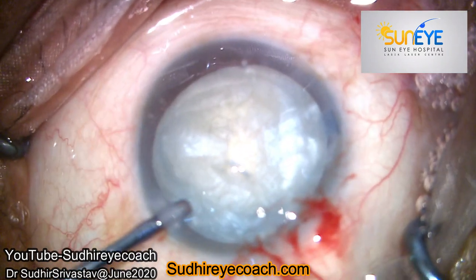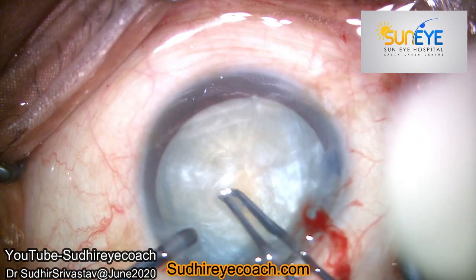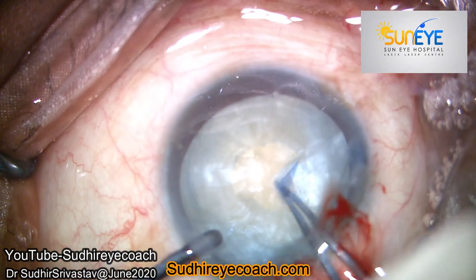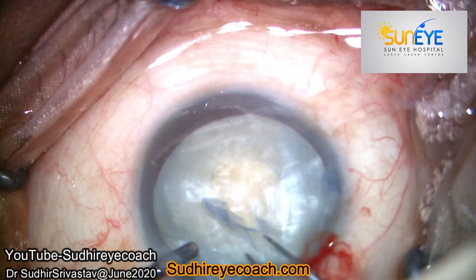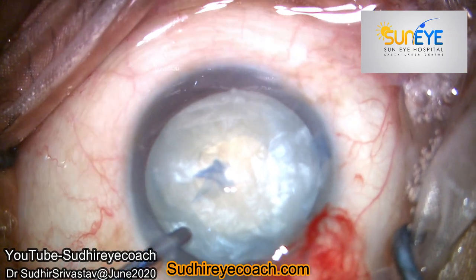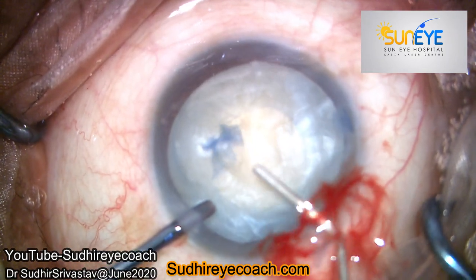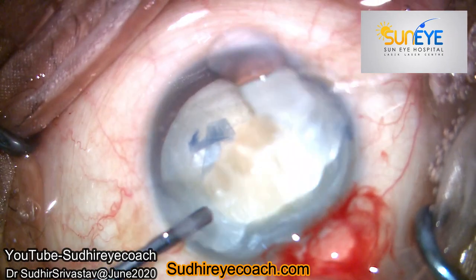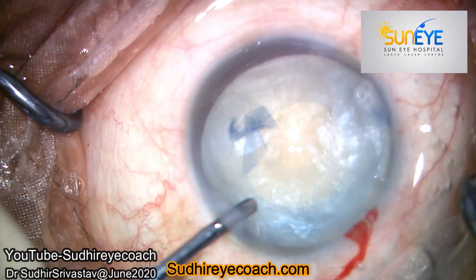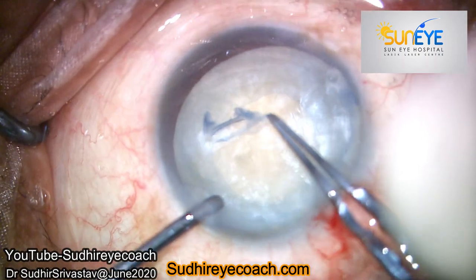I made a small nick and then entered the capsule, and without any problem I extended my rhexis to an appropriate size. Although it was not perfect, it was around five millimeters. Now we have a round capsule opening without any acute angles. Most of the time, white nuclei are not very hard and they are not very difficult to manage with phaco.